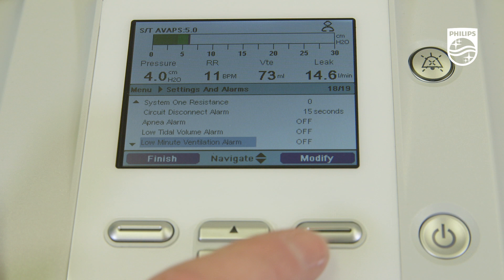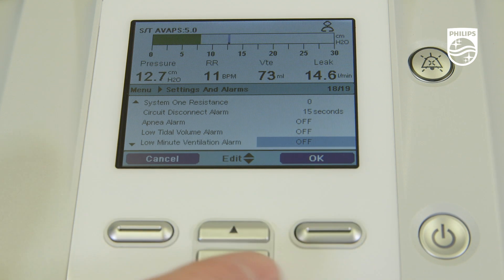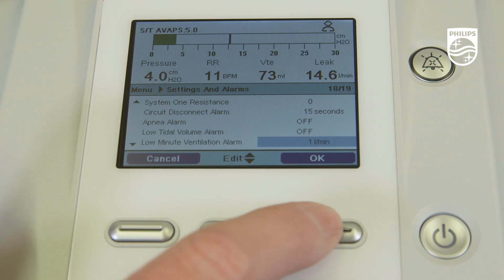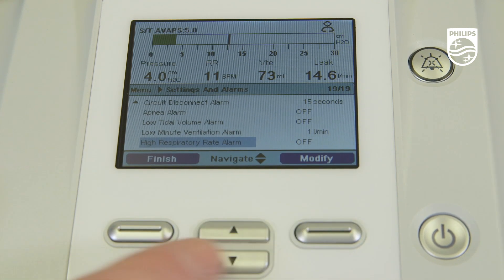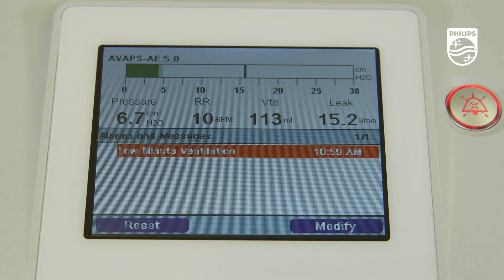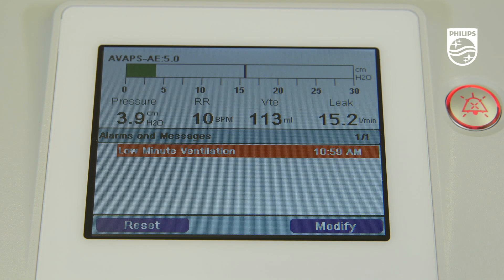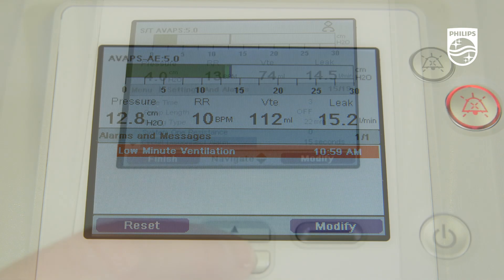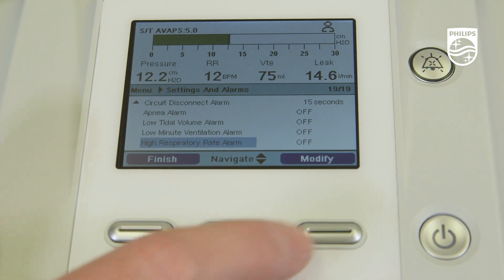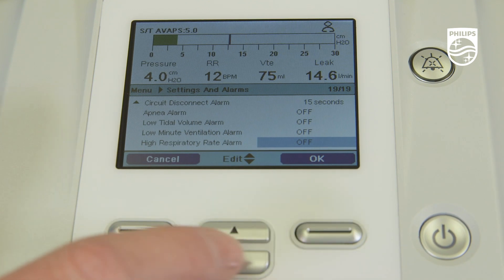The low minute ventilation alarm activates when the calculated minute ventilation is less than or equal to the setting. This high priority alarm will continue until the estimated minute ventilation is greater than the low minute ventilation alarm setting.